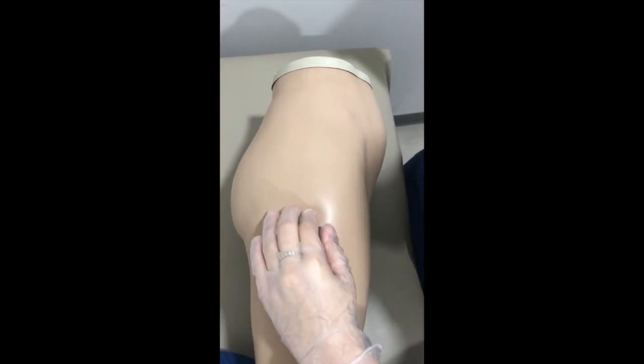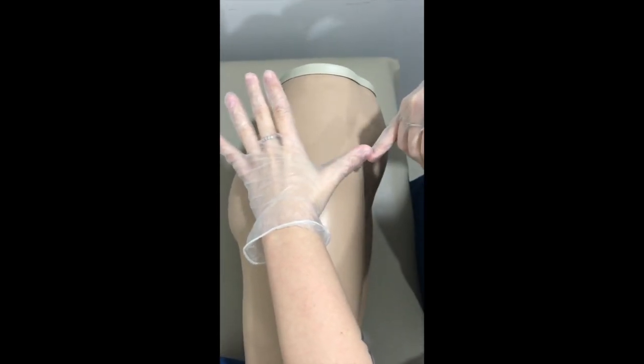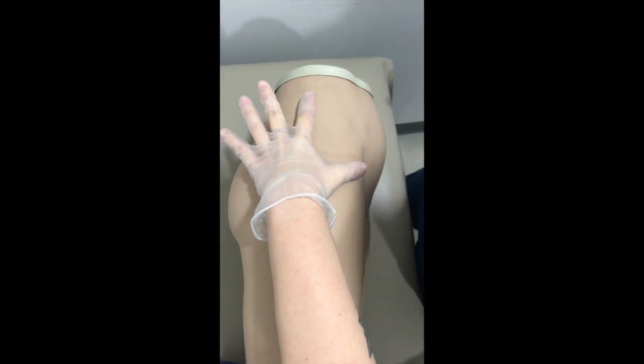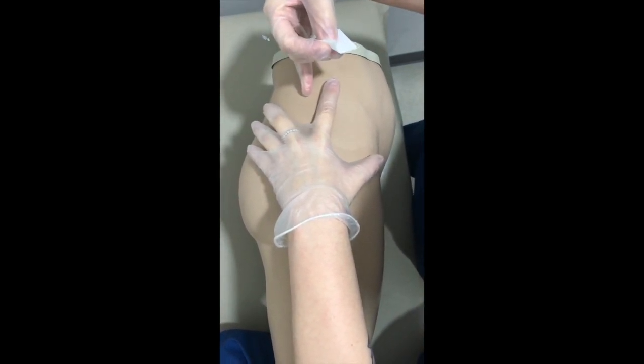We're going to locate Mr. Mancini's greater trochanter. So you're going to try and find the top of the thigh bone, which I'm feeling right there, which is where you're going to put the palm of your hand. And then you're going to put your thumb towards the tummy, the index finger up towards the iliac crest, and then your other fingers towards the back. So this area right in here is where you're going to want to be injecting.